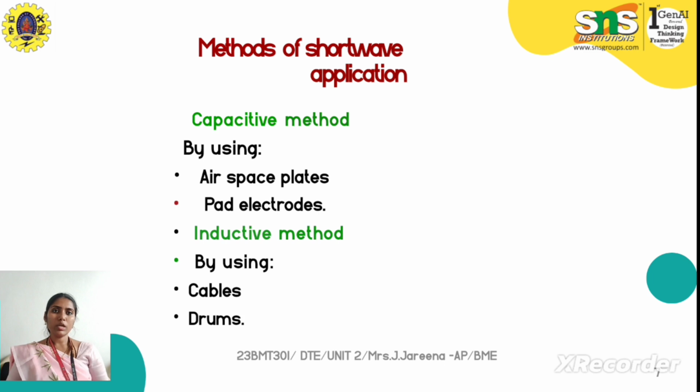So usually there are two methods. One is capacitive method, another one is inductive method. So through these two methods we can go with treatment of shortwave diathermy machine.